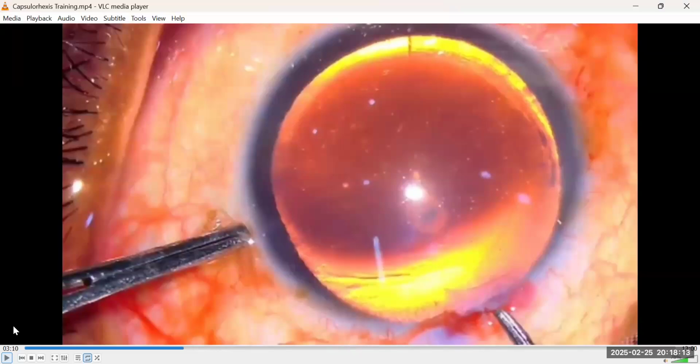And if the knuckle of my cystotome is bent about 1 millimeter, especially if someone did it for me without taking into consideration the surgical anatomy of the anterior chamber, I will finish a rhexis, but I would have used the knuckle to nudge around the corneal endothelium. You finish a beautiful surgery, the next day it is corneal striae that you'll be seeing. Not because you did not do well, but because the concept of the surgical anatomy was a little faulty.